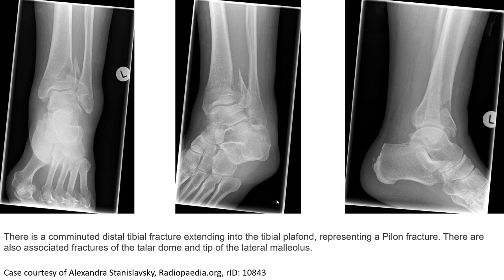This is a second example of a pilon fracture, where we can see there is a comminuted distal tibial fracture extending into the tibial plafond, representing a pilon fracture. There are also associated fractures of the talus and the tip of the lateral malleolus.